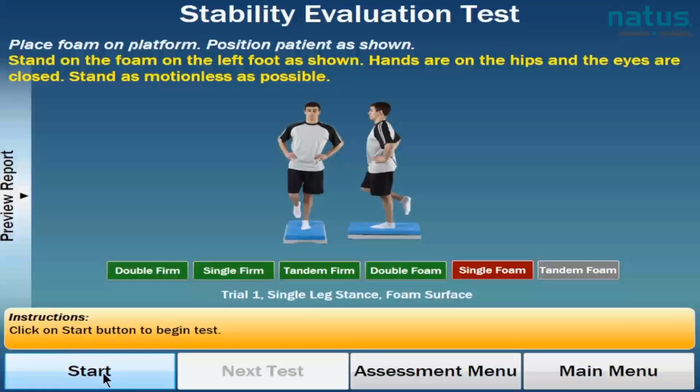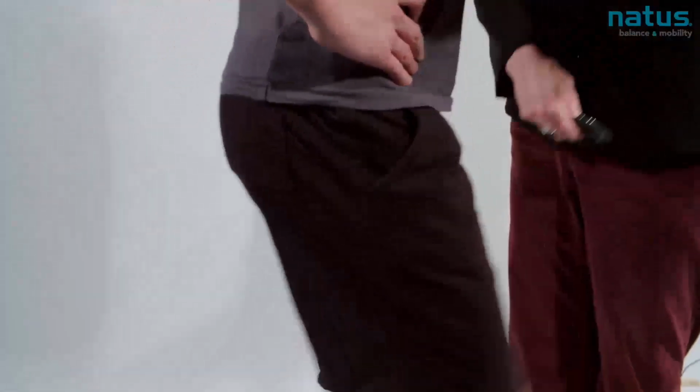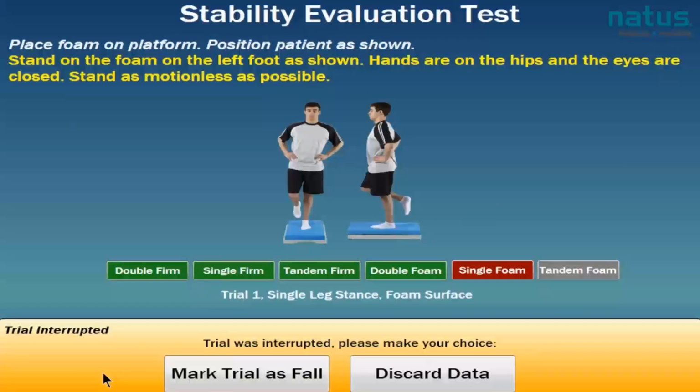Okay, balance on your left leg. When you're ready, close your eyes. His eyes are closed, and again, he loses his balance. And this is a very challenging condition. Even normal individuals lose balance on this condition. I am going to mark this trial as a fall, and I get the prompt to position my patient before starting the next trial.